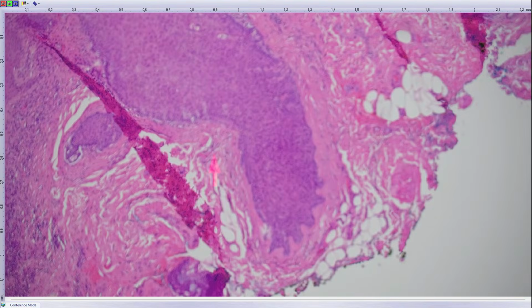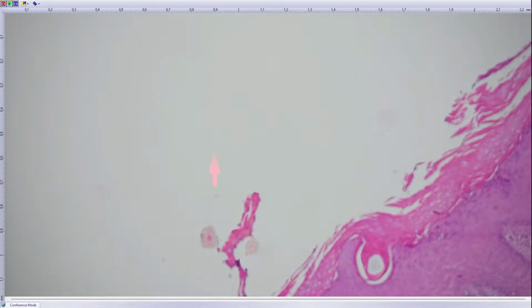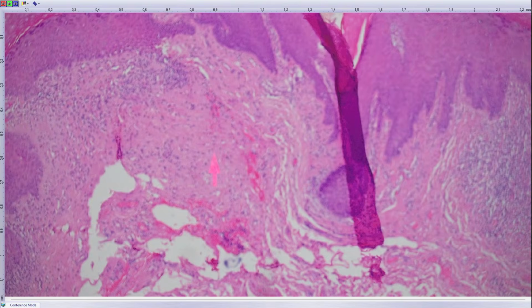Again, you should put into the finding to the surgeon that the lesion is excised in toto, that the rete ridges do not touch the bottom of the excision, and that these very microinvasive cancers usually have good prognosis as to the metastatic behavior.